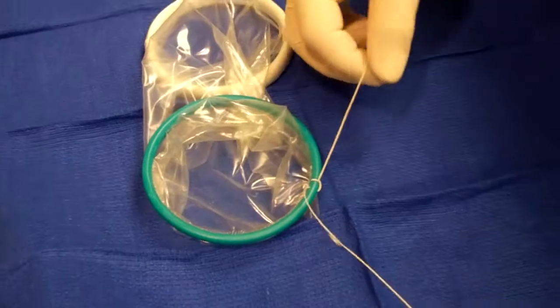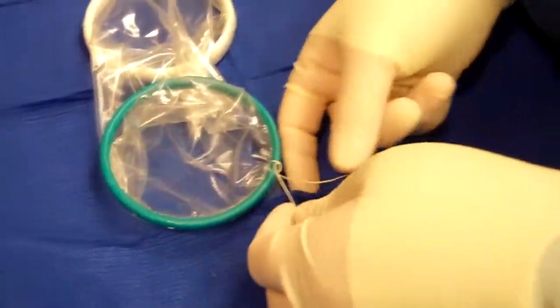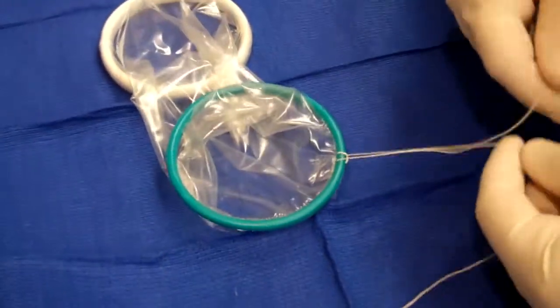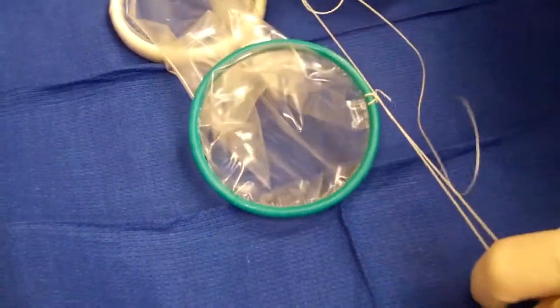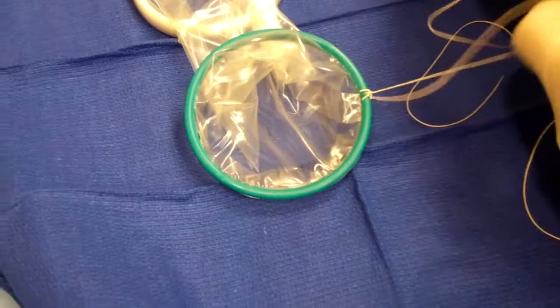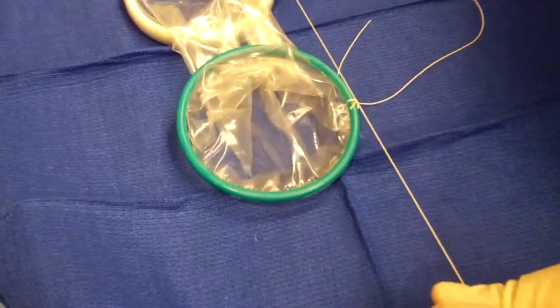Awesome. Beautiful. Great. At least three knots, Brenda. That'd be perfect because I don't want it to come loose during the hole. Good. Now we have a tether. Now she's going to roll it back in so it's covered.